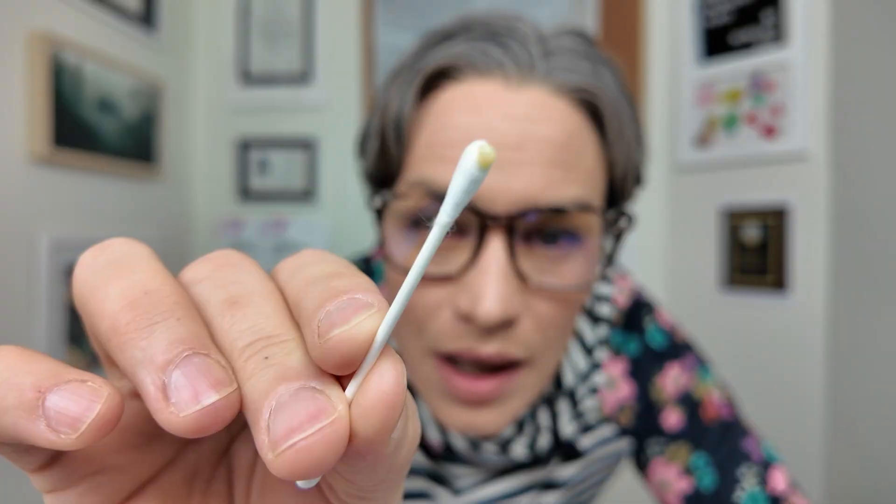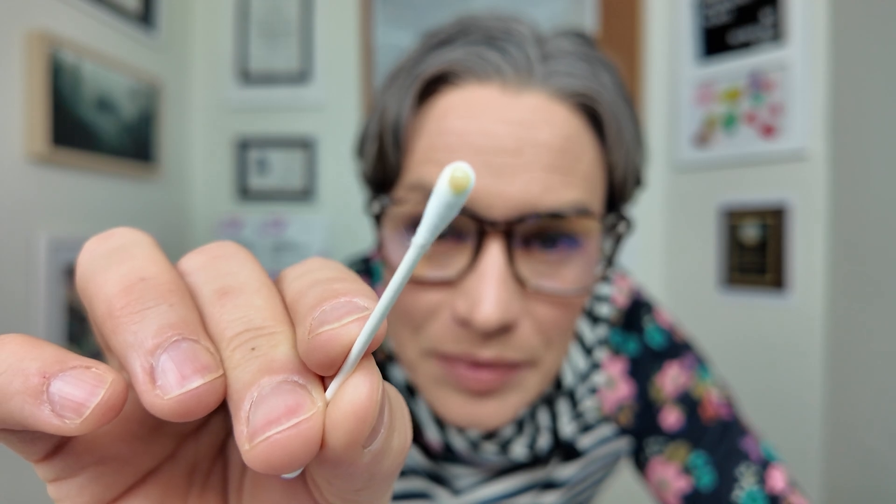Okay, I've got it. We have it right here at the tip of the q-tip. Let's put it on the slide — I need the help of the other q-tip. Let's place it. Let me take the cover glass and let's make a nice smear. Let's check if we can get another sample here with the use of the mirror.